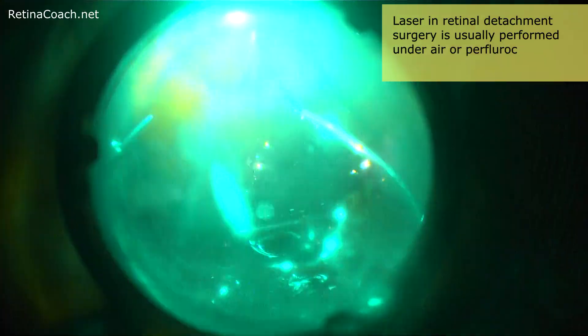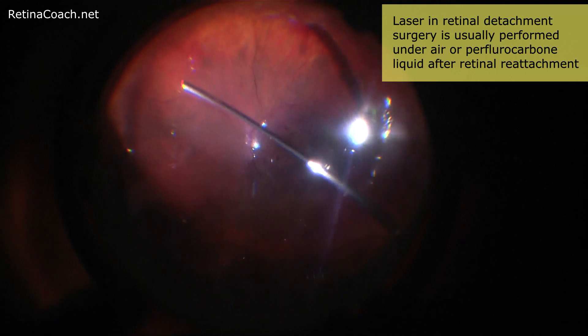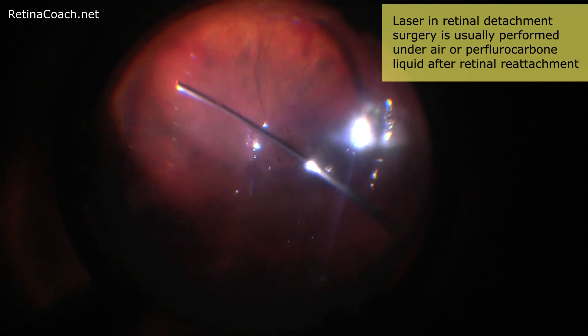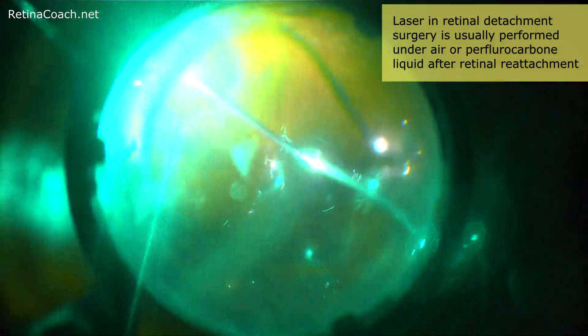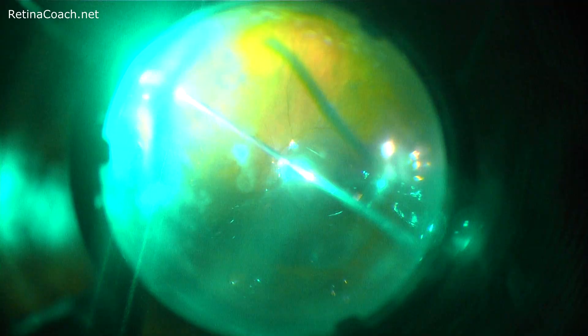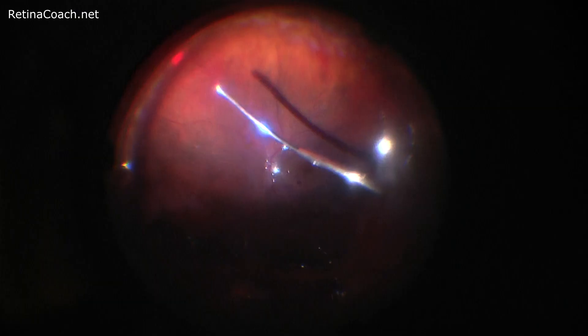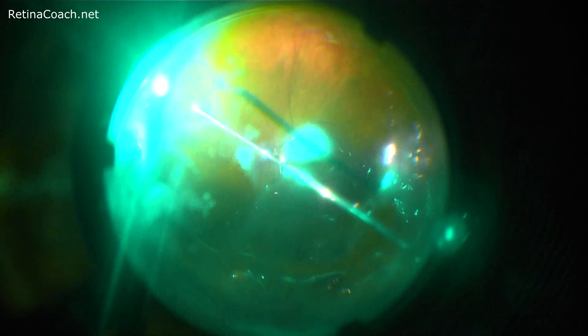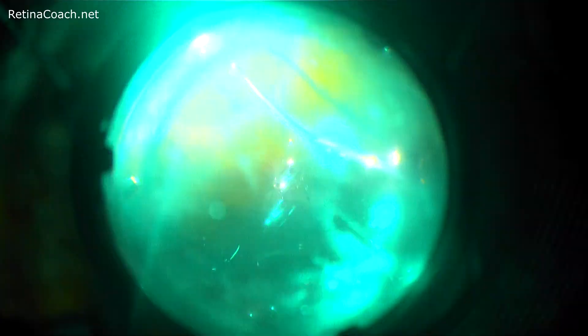First, laser in retinal detachment surgery is usually performed under air or perfluorocarbon liquid after retinal reattachment. Adequate subretinal fluid aspiration allows the retinal pigment epithelium to effectively absorb the laser energy for further scar formation.